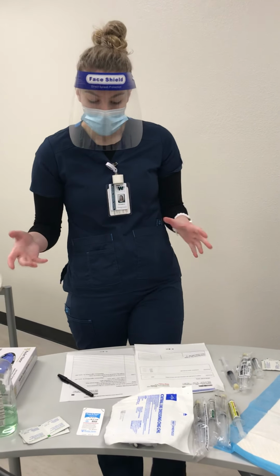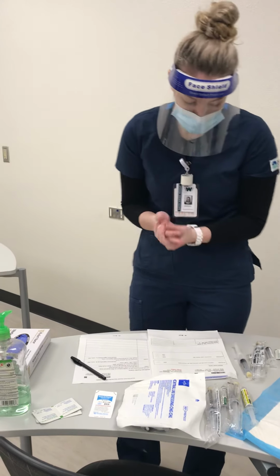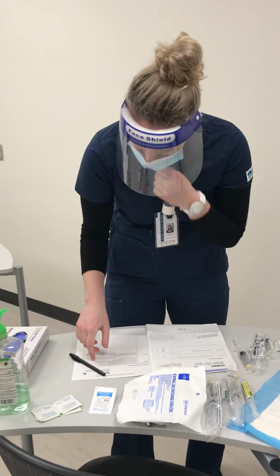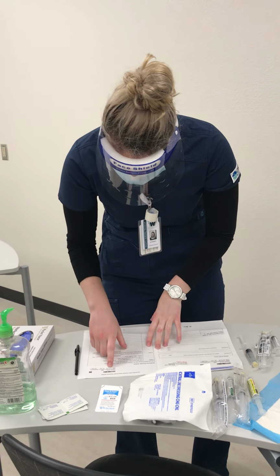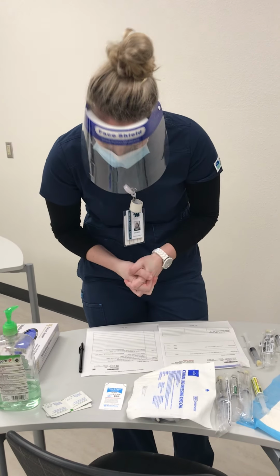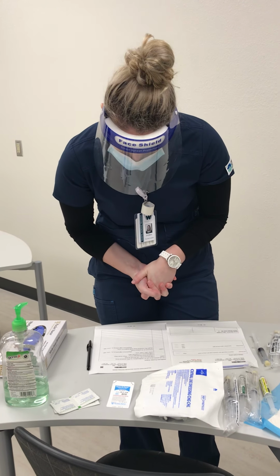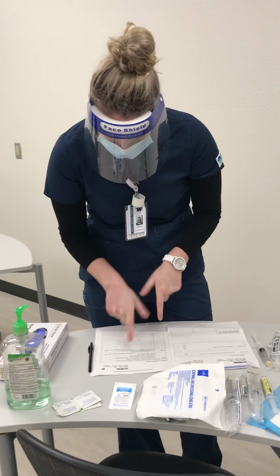So first, I'm going to verify that I have some healthcare provider orders with my MAR. So I'm going to perform hand hygiene, and I see I have client Chester Chest, date of birth 7/19 of 19, and that is the same on my healthcare provider orders as well. So I see the provider is ordering give all IV medications in the central line, use the port for all blood draws, and central line dressing every 7 days, as well as ceftriaxone 1 gram is going to be administered today.